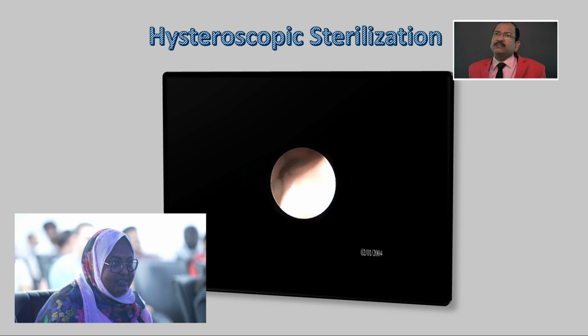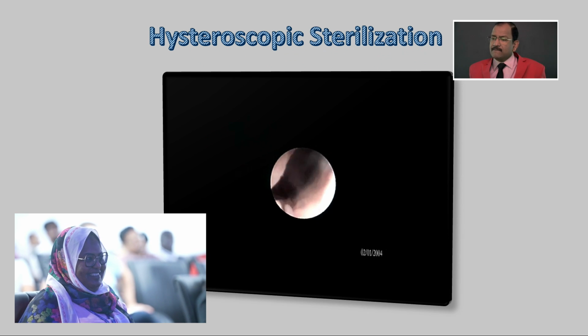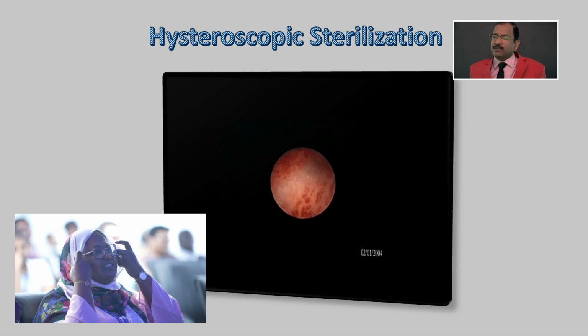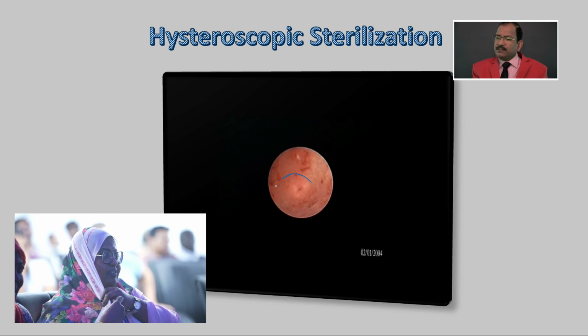Now, this is the internal os, and now the cavity, and here is the ostia. This is one ostia, this is another ostia.